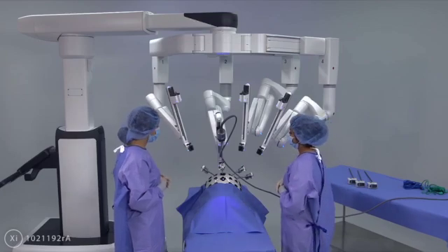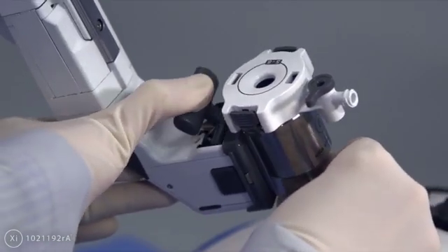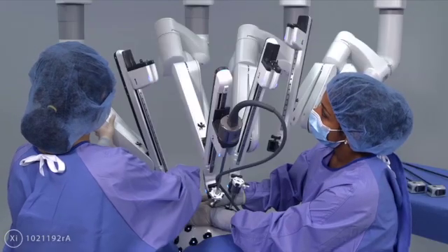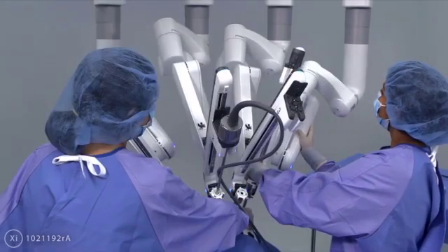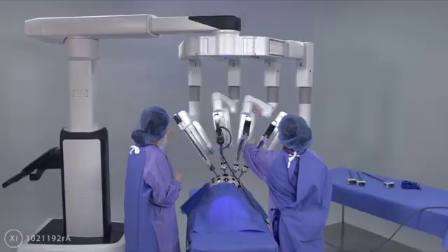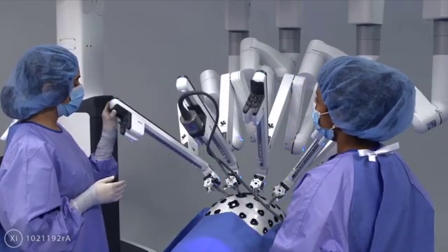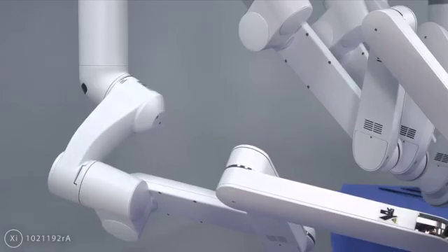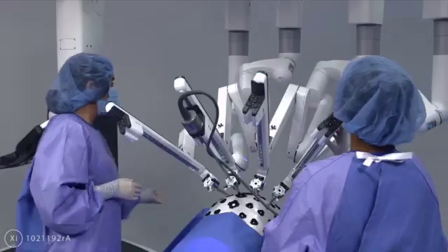Once targeting is complete and the endoscope arm is aligned, the rest of the arms can be docked using the port clutch buttons. Starting with the arms closest to the endoscope arm, the sterile staff adjusts the rest of the arm's flex joints so that all arms are working in parallel toward the target anatomy, leaving a fist-width spacing between the arms. To increase instrument reach, bring the patient clearance joints down, leaving a fist-width space between the arms and the patient.